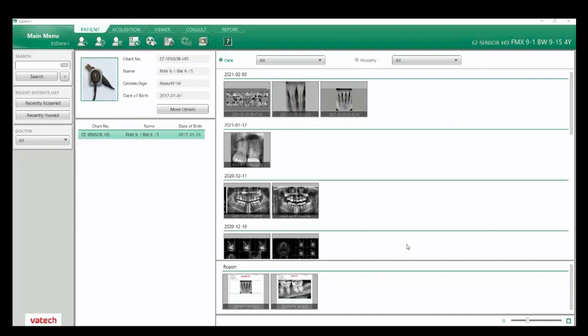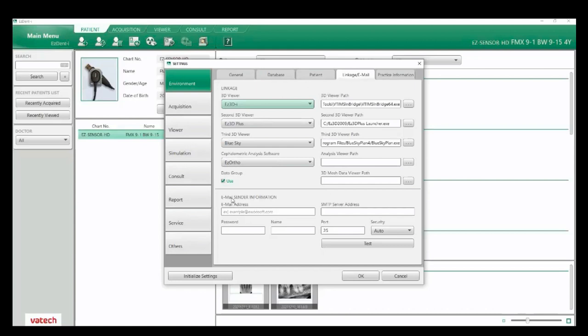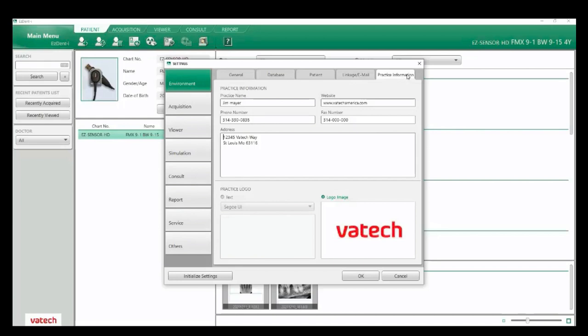Let's go ahead and get started. First, go up to our main menu under Easy Dent I and go down to settings. Under the general tab and teeth code, we can choose our universal system or FDI. We can also go up to linkage and email and add your office email, SMTP server, password, name, and port. If you are unaware of your SMTP server address, I would suggest getting that set up with your IT department. Lastly, you can add your practice information and also a logo on the lower right.